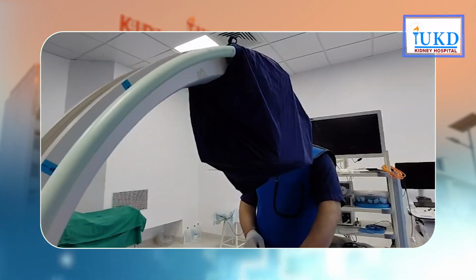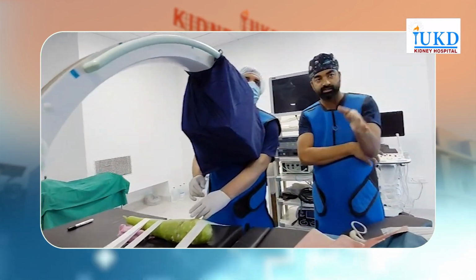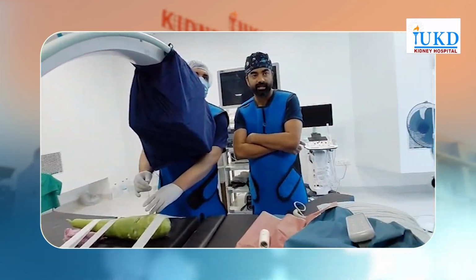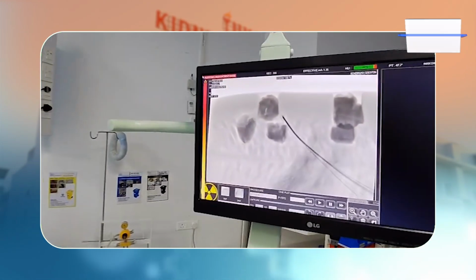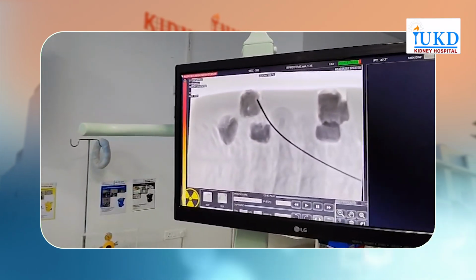I make it 30 degrees. Sir, this one only? Or the lower one? Posterior. So you're a little off at the angle. Come back again. Adjust this. Go towards the calyx again. Very good. You're already hitting the target.